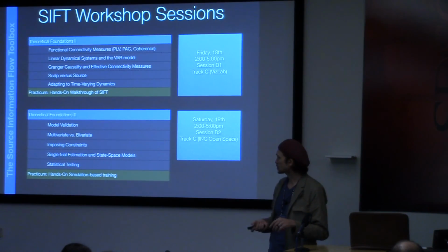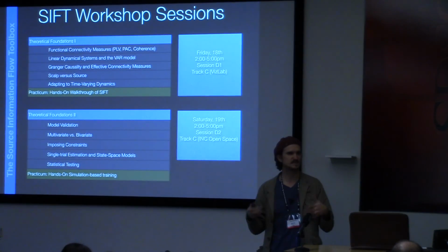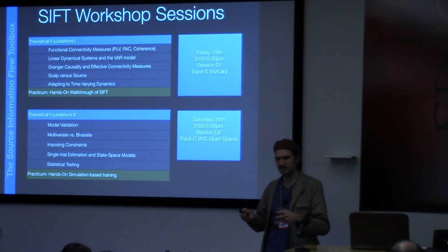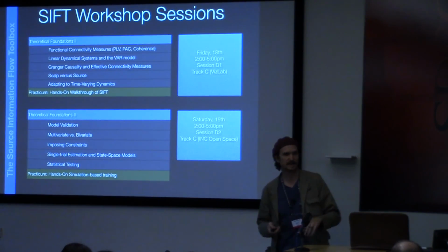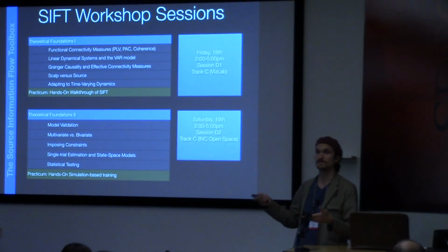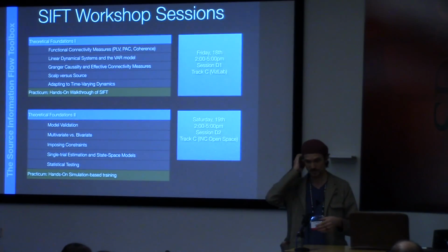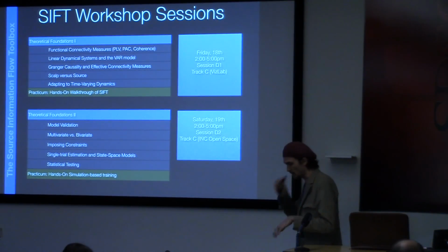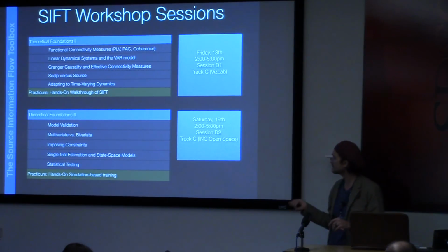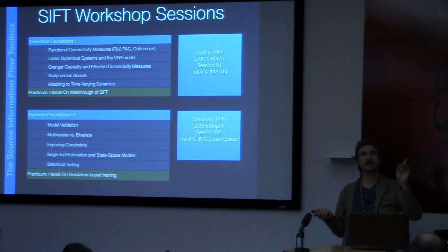And we'll conclude by basically an hour of hands-on simulation-based training where we'll be able to play around with using SIFT's rich dynamical simulation package, explore different kinds of models, and also an opportunity for you to play around with your own data in that session. It's going to be a bit less structured than the walkthrough today. So that's going to be tomorrow, again, 2 to 5 p.m. It's going to be in the INC open space.